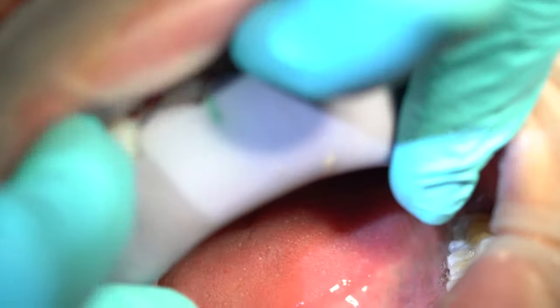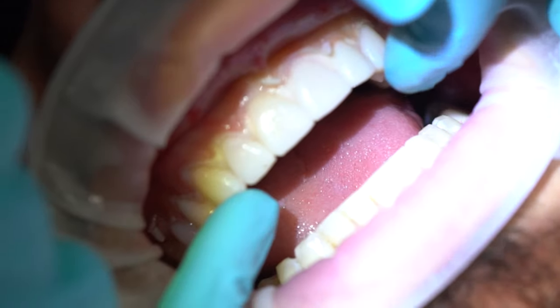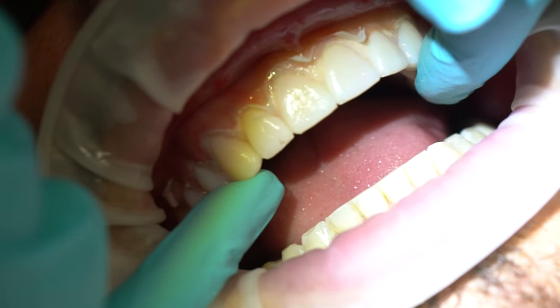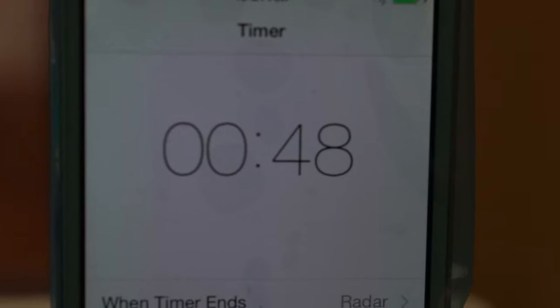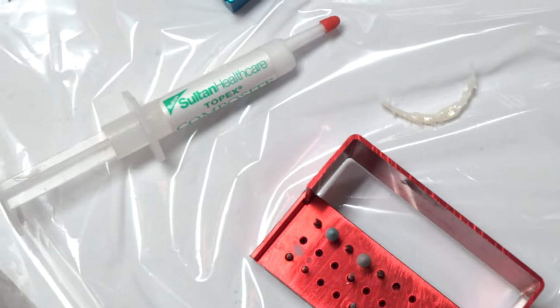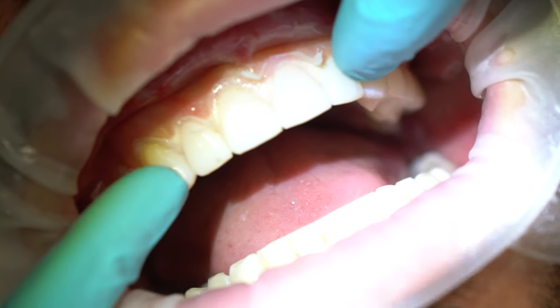I just tried it back in to make sure we don't get any distortion here. I also want to check and make sure that it's thick enough — you can see a little show-through here. I'm going to take a little bit more off this tooth and maybe just a little bit more here. Then we'll trim up the temporaries, touch it up, fill in the air bubble, things like that.